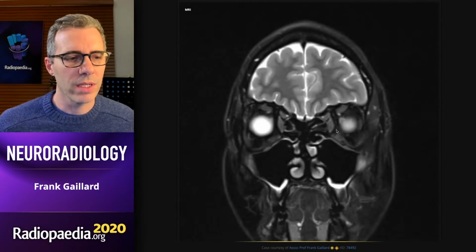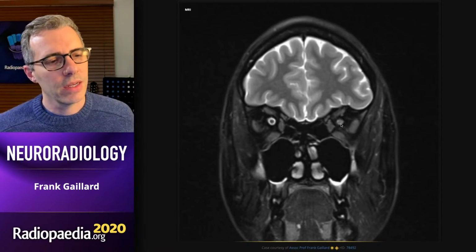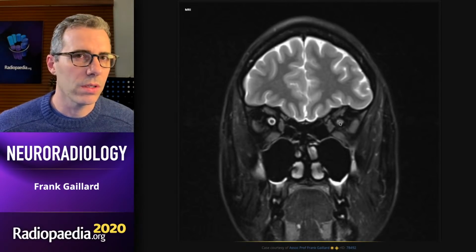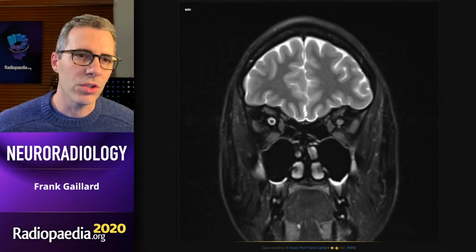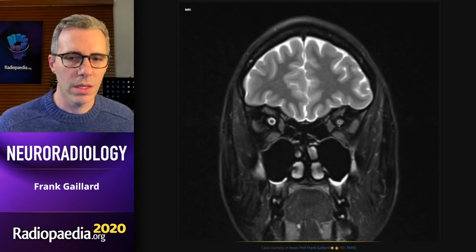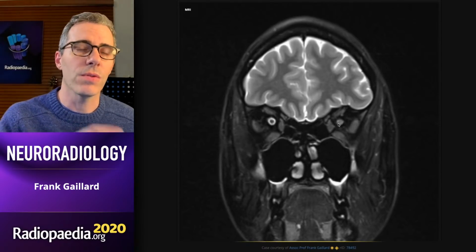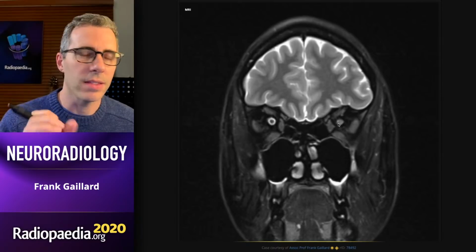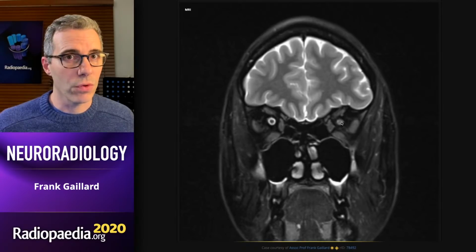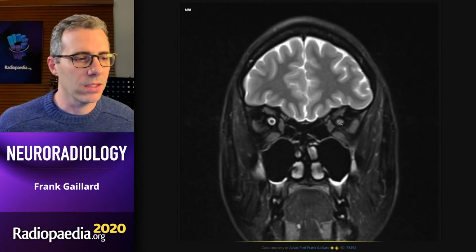When we come further forward, we can see the optic nerves behind the globe are really very asymmetric. On this side, it's hard to know what size that optic nerve is. It looks small, but it's difficult to judge because the degree of CSF surrounding the optic nerve in the optic nerve sheath is much, much less. And whenever you have great differences in T2 signal surrounding a structure, it becomes really hard to identify the size of the structure or the internal signal. So you could zoom this up, maybe take an ROI to try and understand whether there is high T2 signal within the nerve. There probably is because we see prechiasmatic high T2 signal.